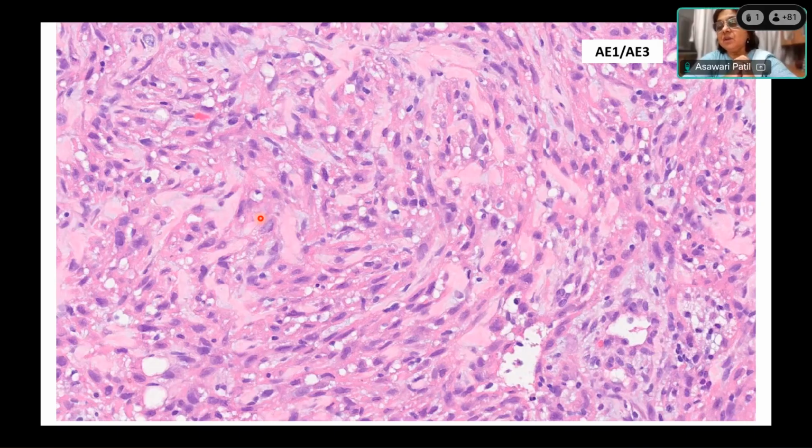what else? There is one more tumor. Commonly we see that. It's not uncommon. You want to call it sarcoma? Yes. Sarcoma is one possibility. Primary sarcoma of breast, and usually primary sarcomas are angiosarcomas. What else? There is another tumor you are missing. Malignant phyllodes also. Don't forget that. Malignant phyllodes can have stromal overgrowth, and in biopsy you may not get any ductal components at all. So that's why you need to consider all these possibilities.